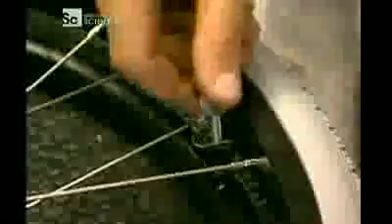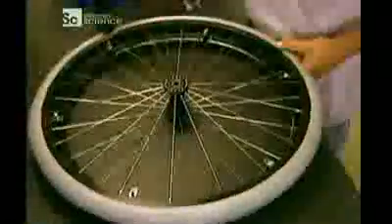The spacers on the hand rim align with the brackets on the wheel. Workers join them with industrial strength 4 centimetre steel screws. You buy replacement parts, much like you do car parts, through specialised dealerships.